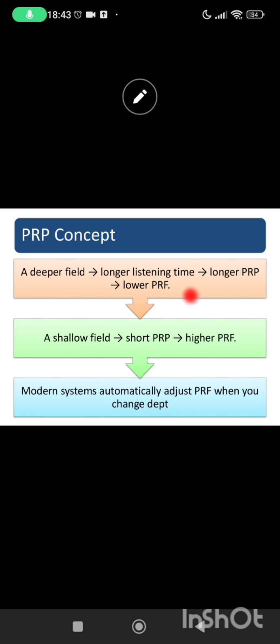What about frame rate? Increases or decreases? Lower for more deeper. Frame rate reduces. Yes, because it's taking more time. So less information is gathered. So frame rate is reduced. Less number of images displayed per second.